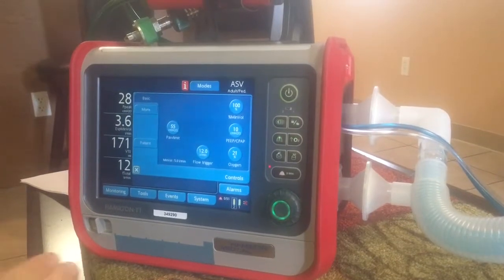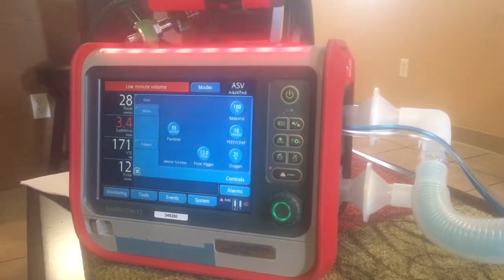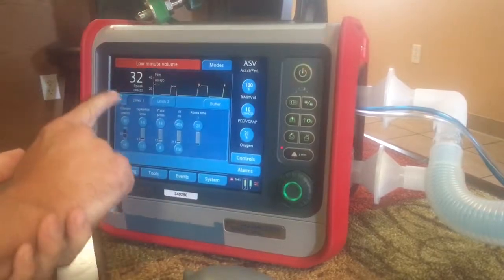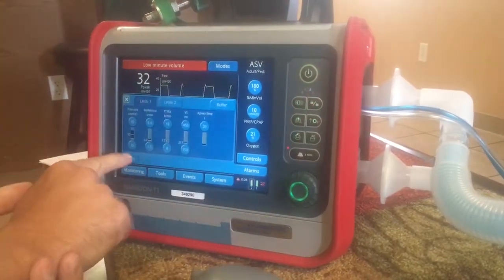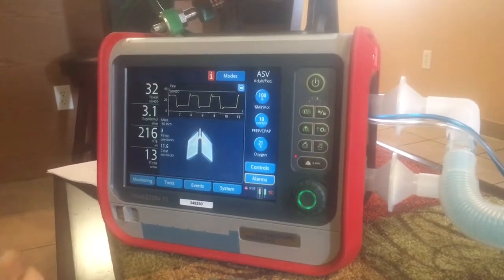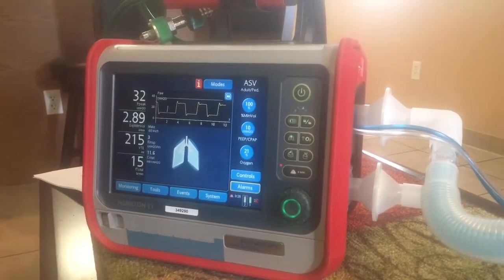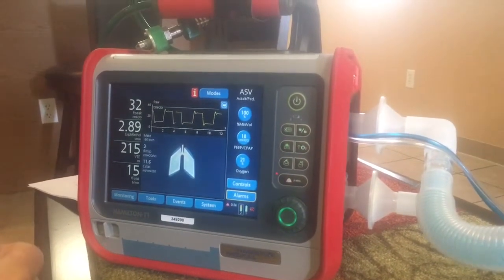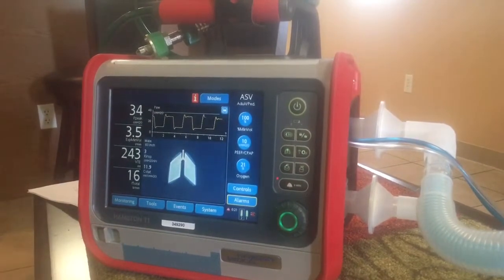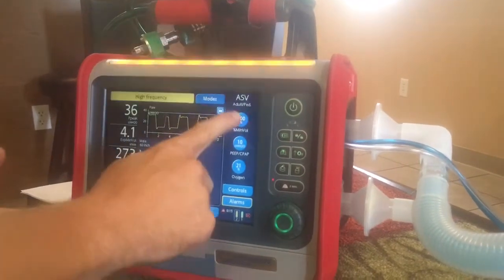What we do set is something called a percent minute ventilation. Minute ventilation is your respiratory rate times your tidal volume — it's the amount of gas that you move in and out of your lungs over a minute. We always start with 100% minute ventilation on our patients. Based on that, it's going to calculate a minute ventilation appropriate for somebody with a 50 kilogram body weight.